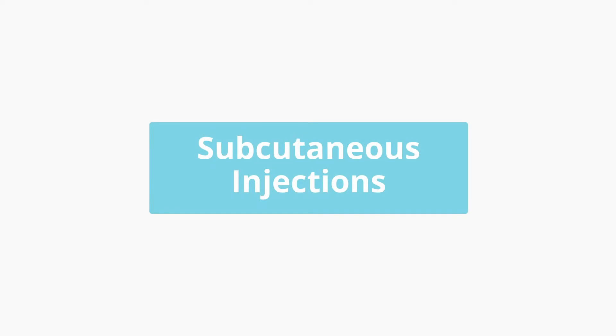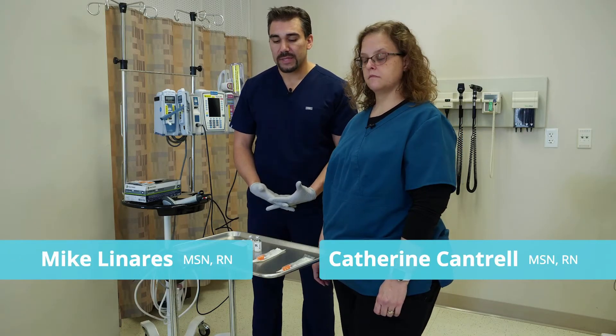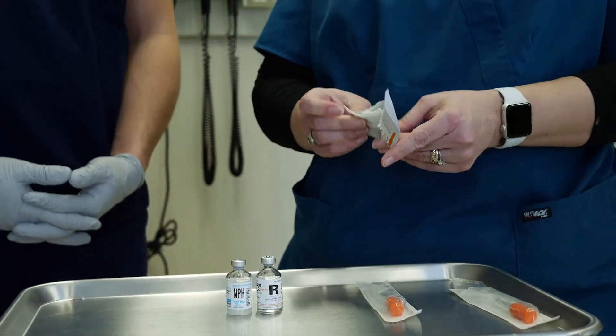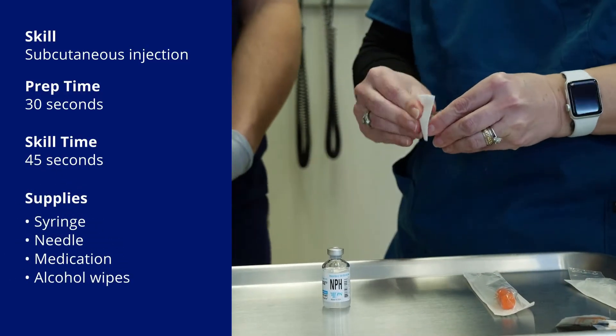When it comes time to draw up the insulins, just know that regular and NPH are on the buddy system — they're the only ones that can be drawn up together. We're going to be taking off the caps. Make sure we always sterilize the tips of both. Anything that you're drawing up always has to have aseptic technique, so give it a good scrub.